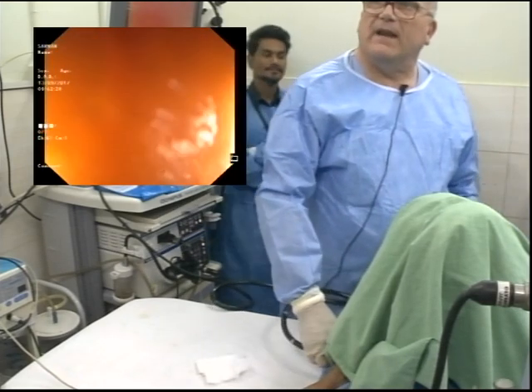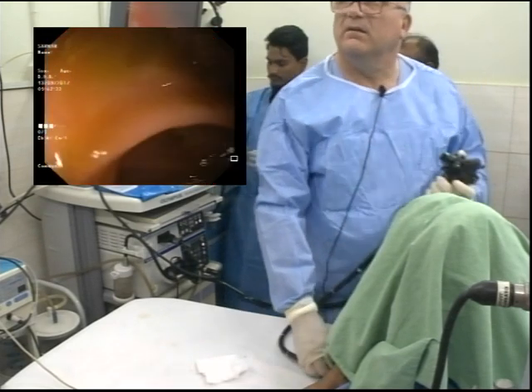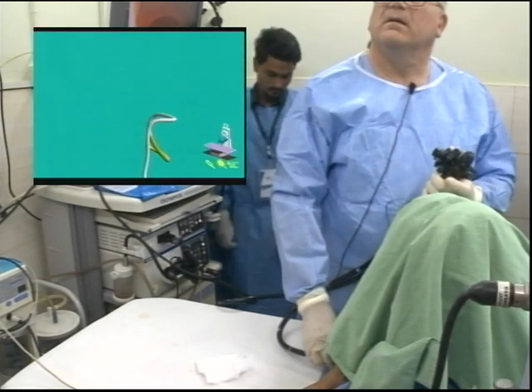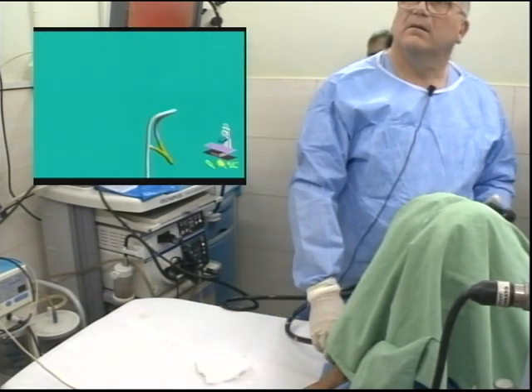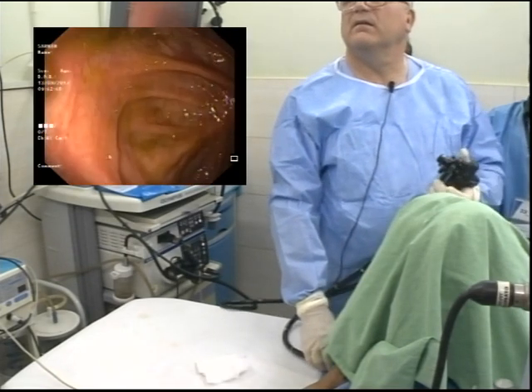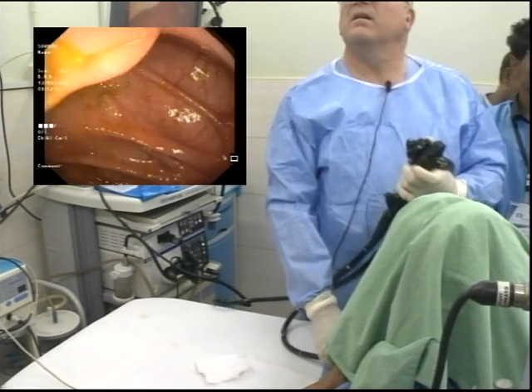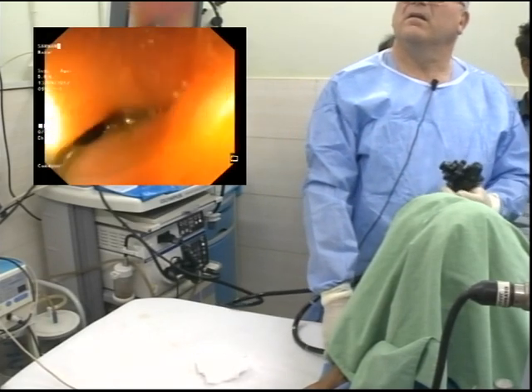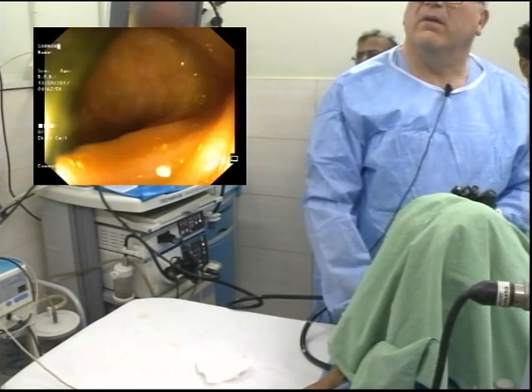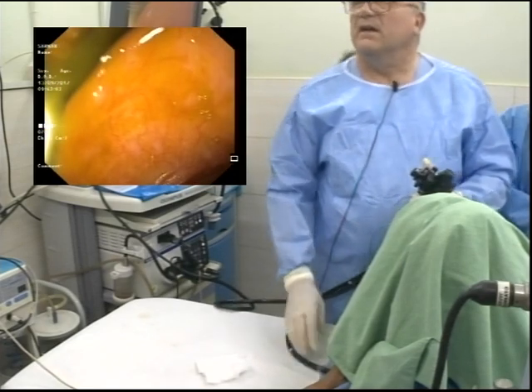Now, if you watch, the left hand's pointing the buttons to the floor. Big wheel comes back, big wheel goes forward. We can't see it, but what's happening here is we want an anti-clock, trying to get into the ileocecal valve, right? So you want an anti-clock. So I'll wait. And there we go. Yeah, just wash away, my friend.